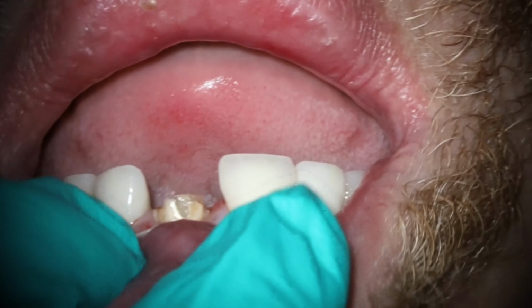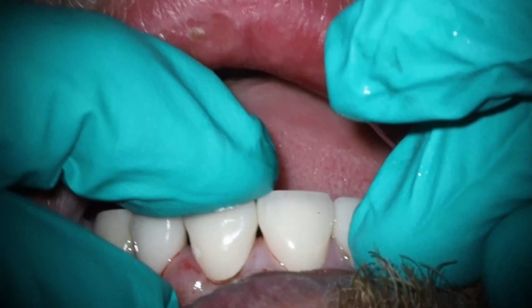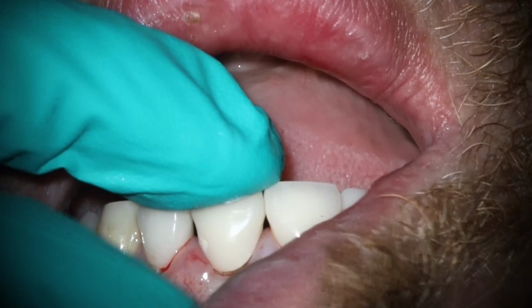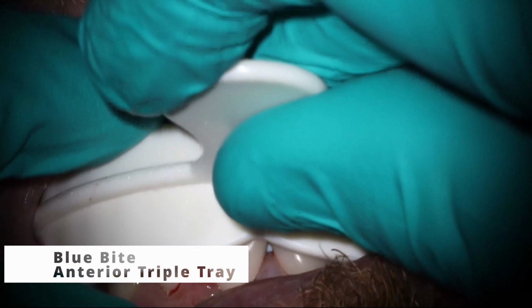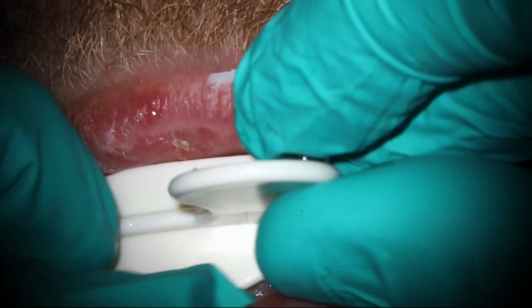Patient presents like this with a broken off tooth. I still have the crown though, and I know that the dentist he's going to doesn't have a CAD/CAM system, so she's going to have to make this traditionally. And if she has to go in and not have any idea of what the crown looked like, that's going to be a problem, but she also wants me to put a post in there and build it up. So what I ended up doing is taking a triple tray, real quick with the blue bite, and taking a quick impression here.